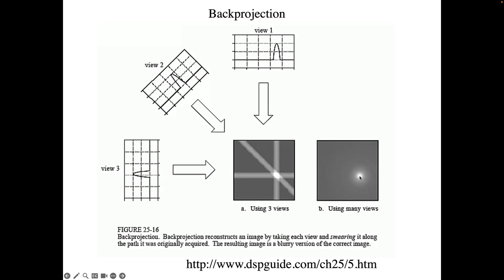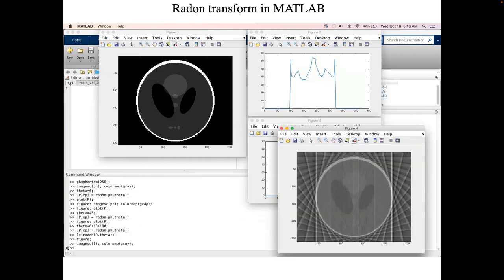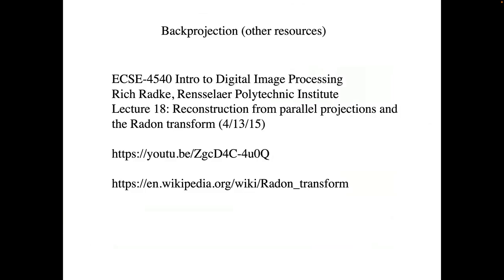Like you've got a peak right here that's right on dead center of that circle. But these edges here don't look anything like a circle. They sort of roll off like this. And there's this stuff in the background. So you can imagine all of this stuff is back here, and so it's a very blurry version of your object. It's called naive back projection. We'll do this later when we talk about the radon transform.